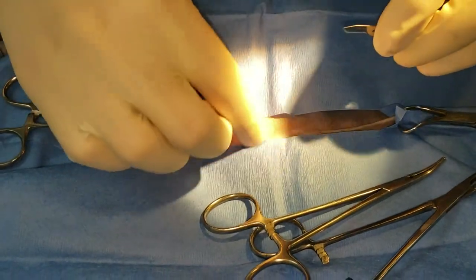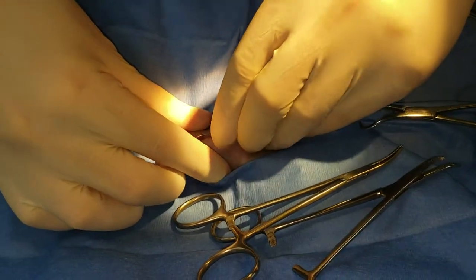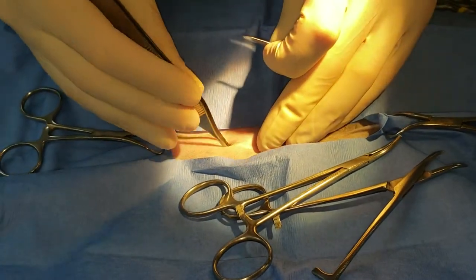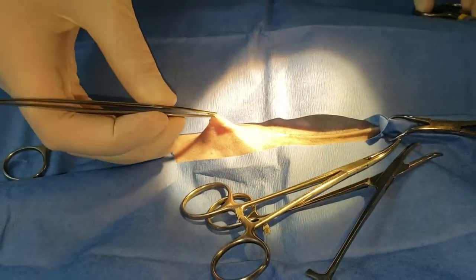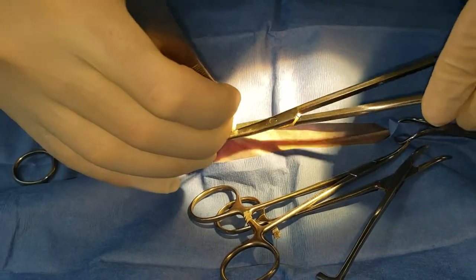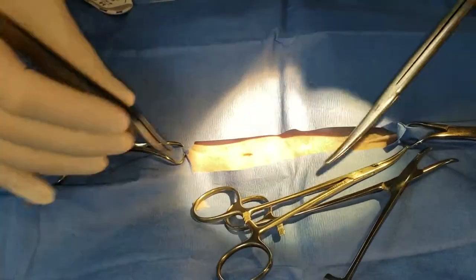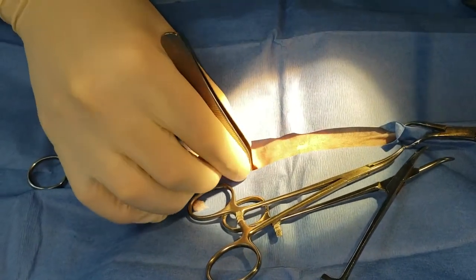I make a small incision with a 15 blade and then grab the sub-q fat with some Brown-Adson forceps and cut it off. That gives me direct access to the body wall. I only do this with cat spays and dog spays — otherwise I actually divide the tissue properly.